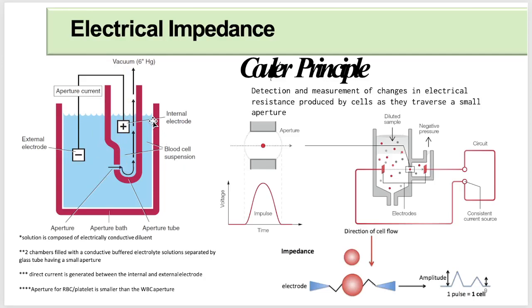This is actually your blood cell suspension. What is that solution? It is a solution composed of an electrically conductive diluent.